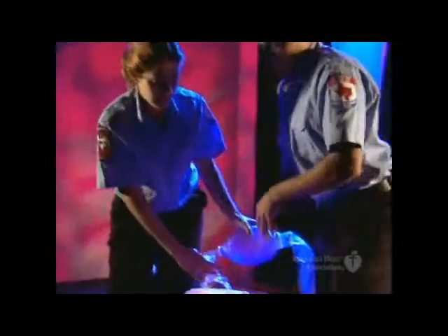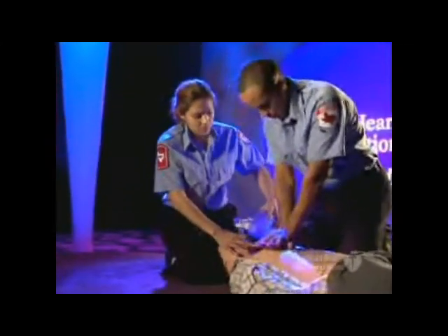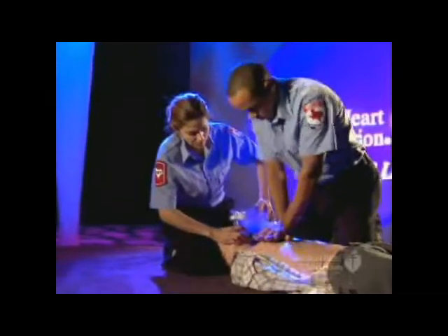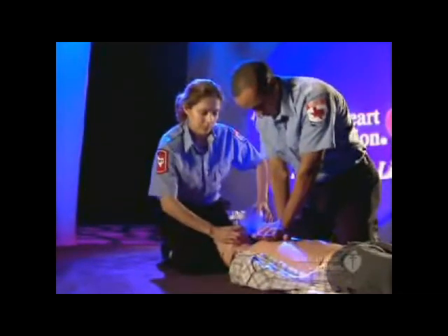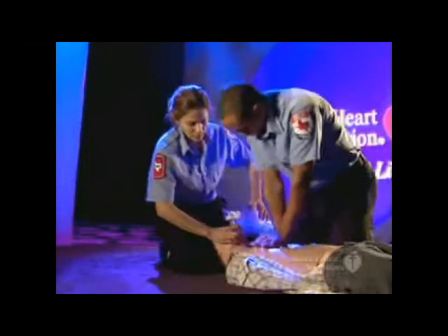If you're performing 2 Rescuer CPR, you can use the EC clamp technique to hold a mask in place. This technique requires instruction and practice. Here's your chance to do it. As before, practice along with the video. Are you ready? Here we go.